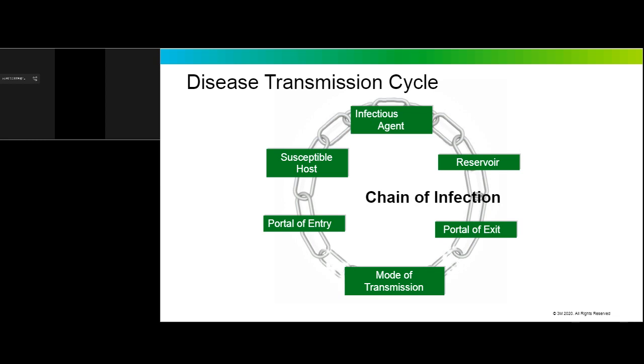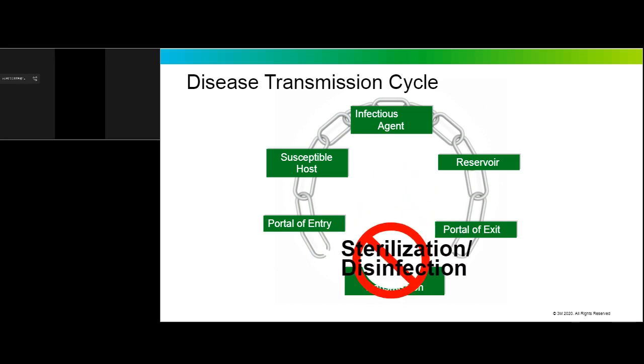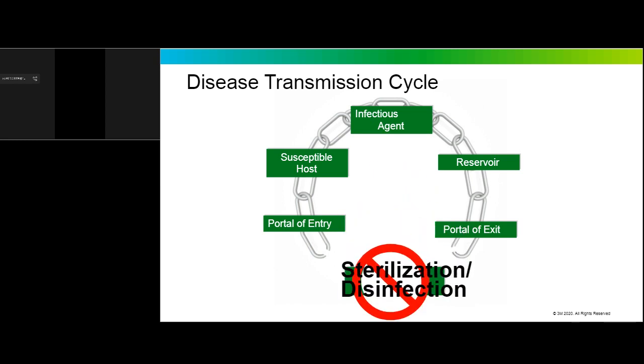So your work in sterile processing helps to break this chain of infection. And by carefully cleaning and then sterilizing or disinfecting reusable instruments, the disease transmission cycle is broken, helping to prevent surgical site infections caused by inadequately reprocessed instruments.